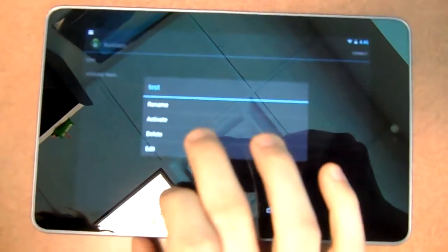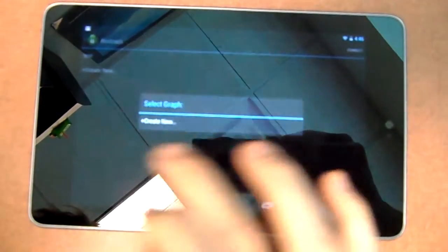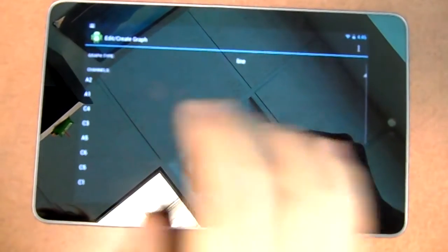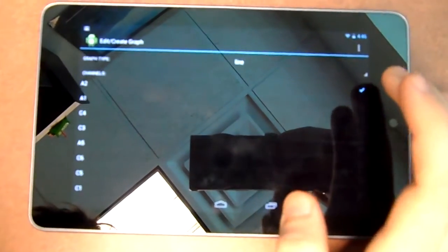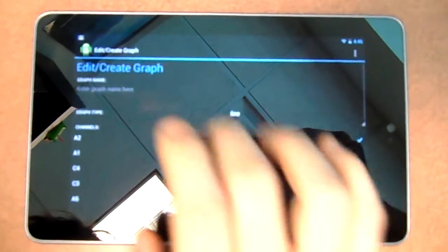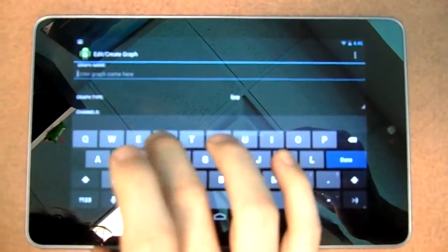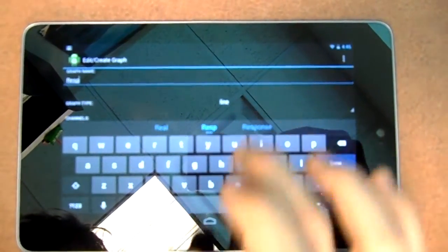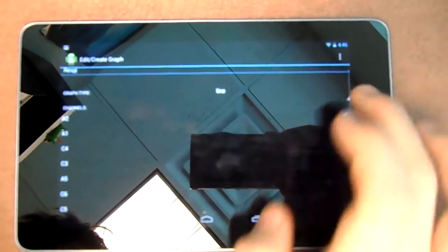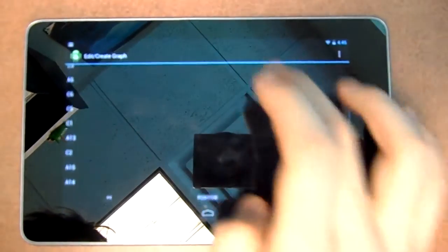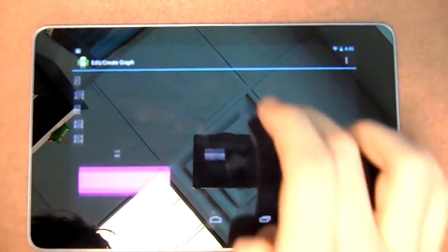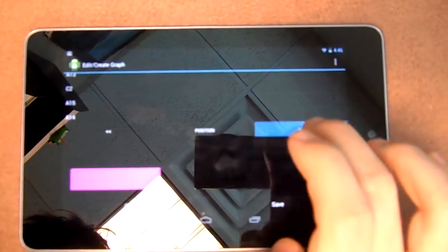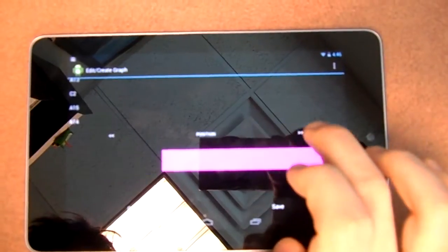We're going to do two different graphs today. The first one we'll call rest for respiration because I'm hooked up to that, and that's on channel a2. It's going to be a line graph and we want this one to take up the whole top half of the screen.